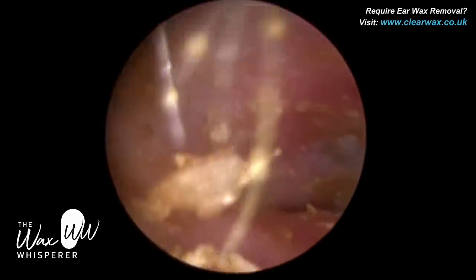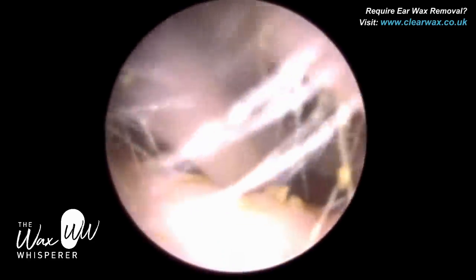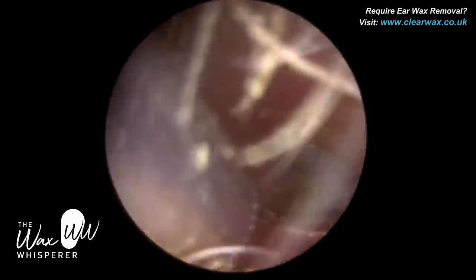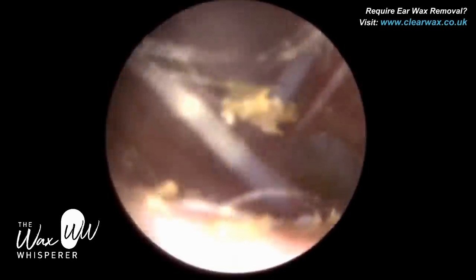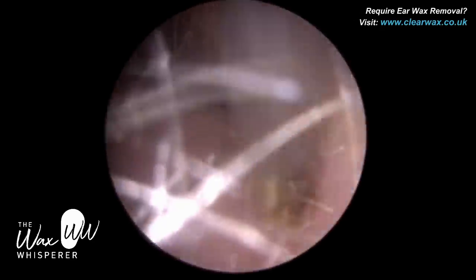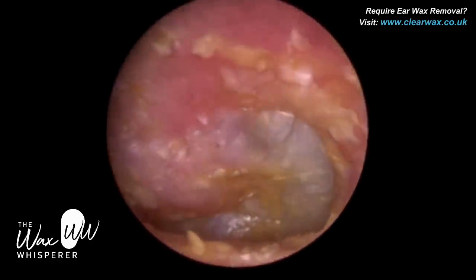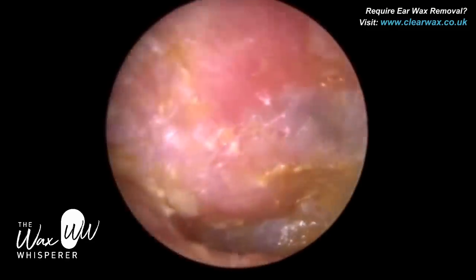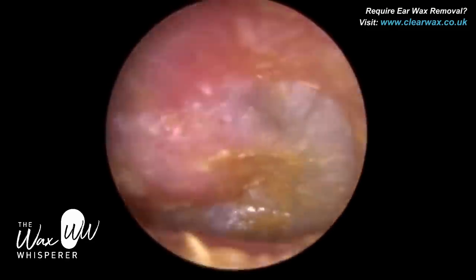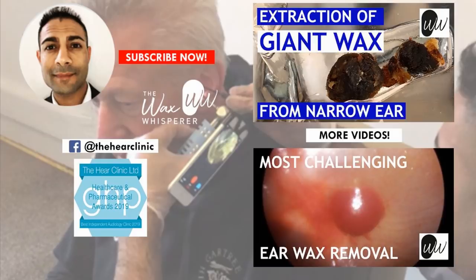There's the final view of the eardrum — we'll see that in a moment. I'm just going to mop up a bit more at the entrance. Some people ask why I don't use dry mopping — that's a technique where you get cotton wool, insert it on the reverse end of a Johnson horn which is serrated, place the cotton wool in there and spin it. But that can graze the ear canal, so we don't want to do that. The tympanic membrane is healthy; you can just about see the light reflex. The handle of the malleus is slightly inflamed because the wax was pressing up against it, but that will settle down.